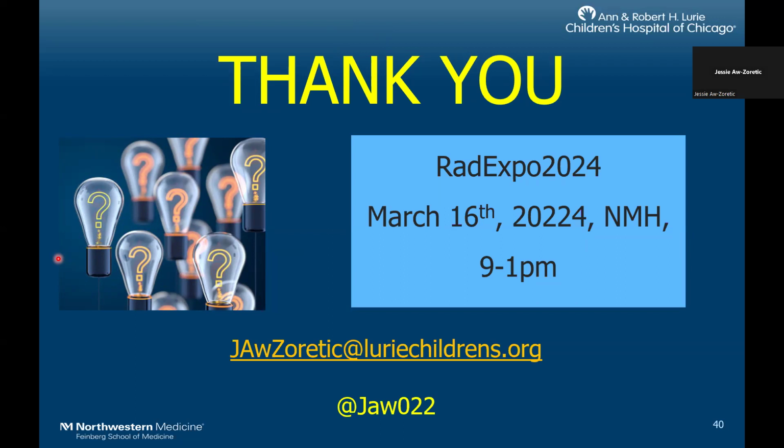We have revamped the Lurie protocol, and we are including a lot more ASL, not just in HIE but in other entities, and yes, we will see that with the inpatient here. We haven't implemented that at our offsites.